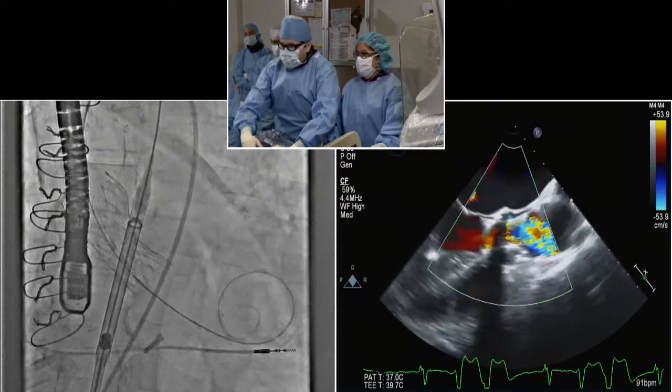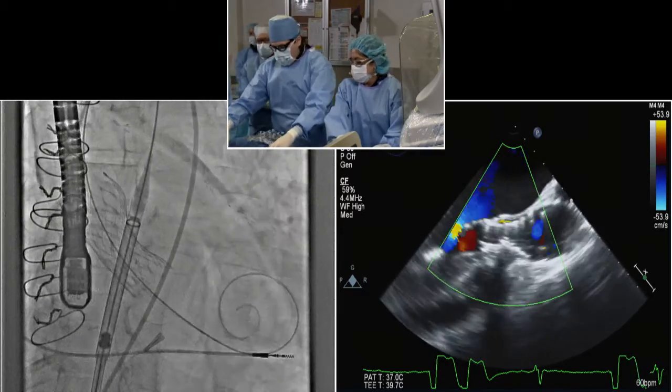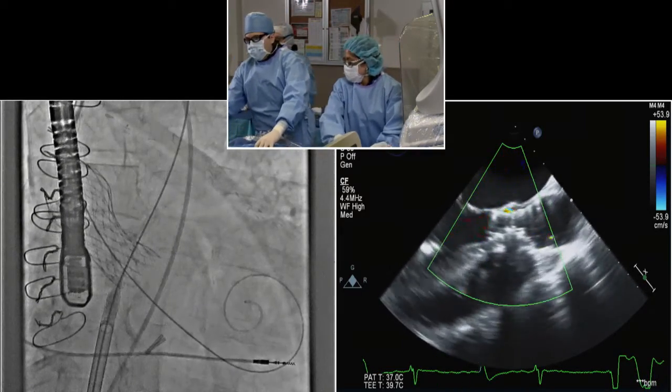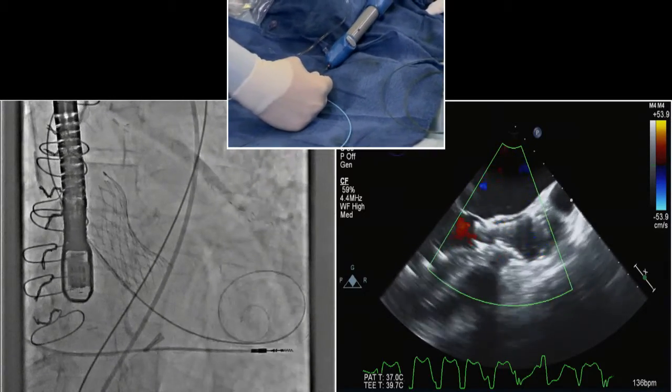It's not quite closed. Okay. So just keep the wire in. I'll take it out. Je prends le nucléus 25 que j'ai demandé. I would say the position is just one second, great. Please. Sure thing.